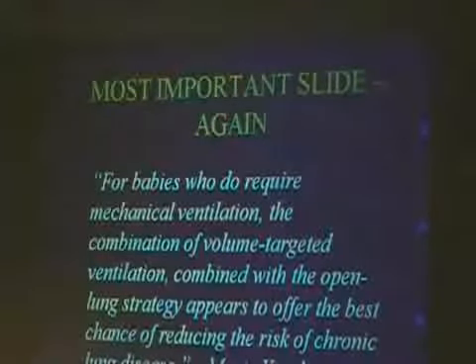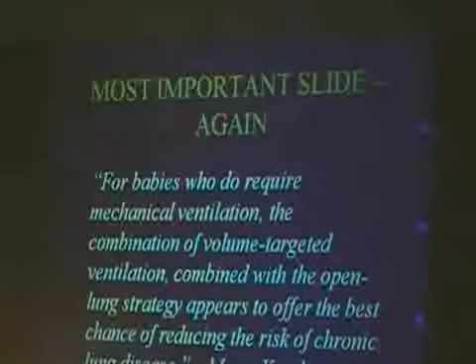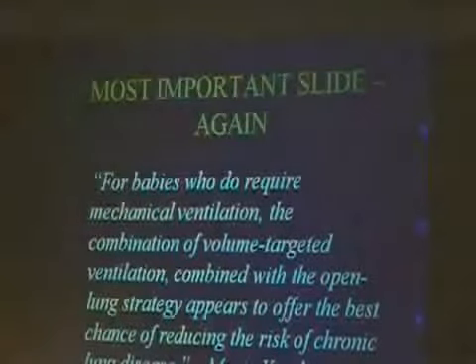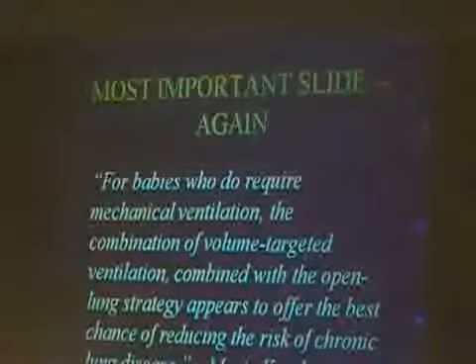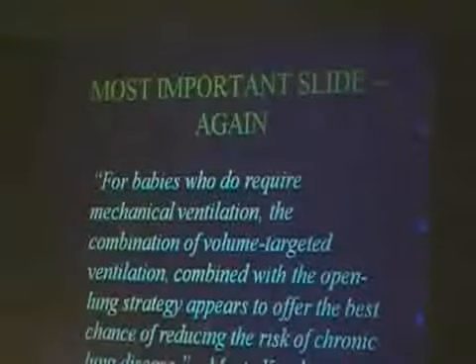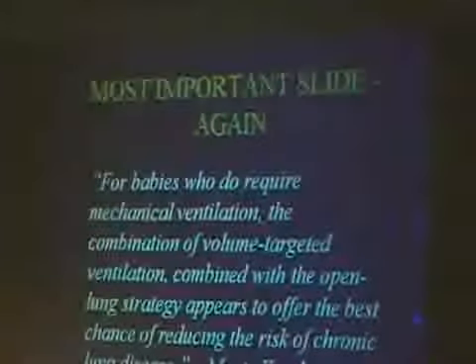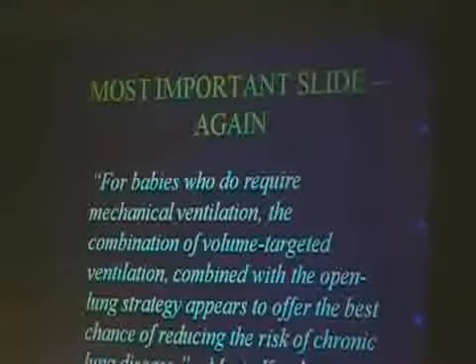What's the open lung strategy? The open lung strategy is optimal mean airway pressure. Oh, okay. The lung is open, but it's not over distended. Is volume guaranteed? You said it's still pressure.